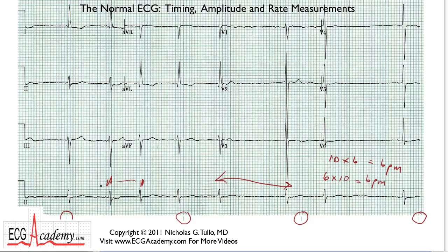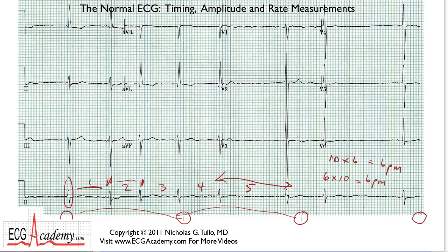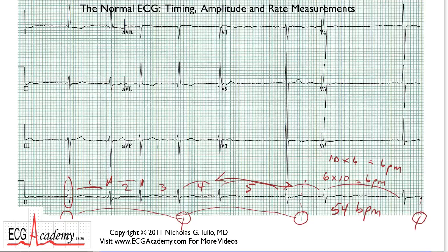Find a QRS more or less close to one of the three-second marks. This is three seconds and this is six seconds. Count the R-to-R intervals in six seconds: one, two, three, four, five — maybe five and a half. That gives a rate of about 54 beats per minute. If you measure a different segment, you might get 42. This is a challenging ECG because the rate is so tremendously variable. But it gives you a tool — a way of measuring grossly irregular heart rates using these three-second marks.